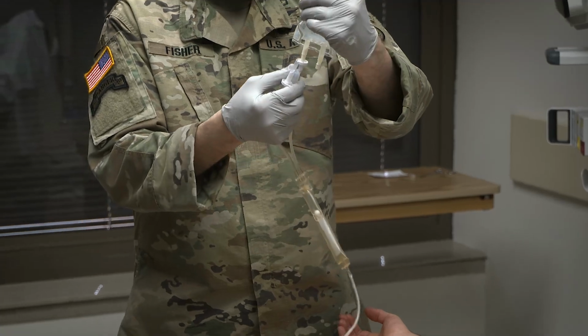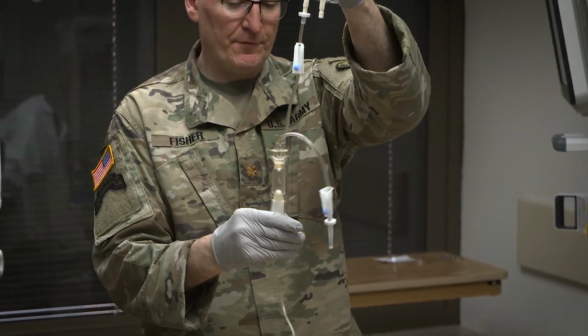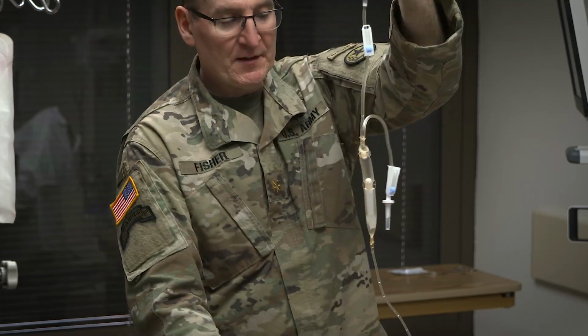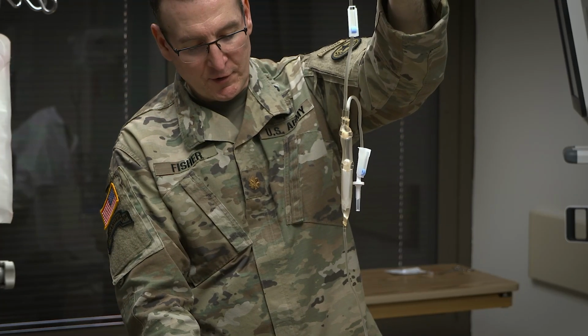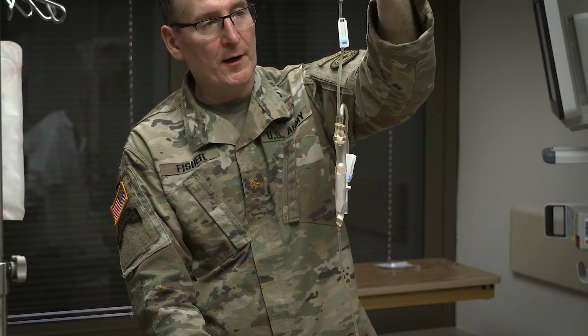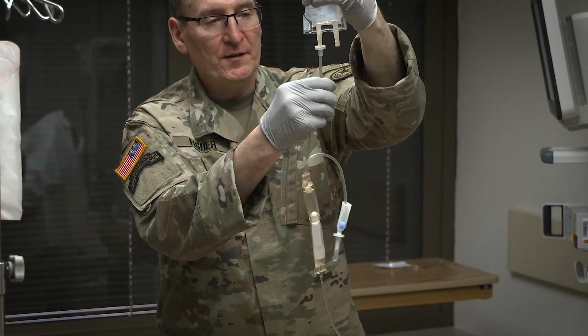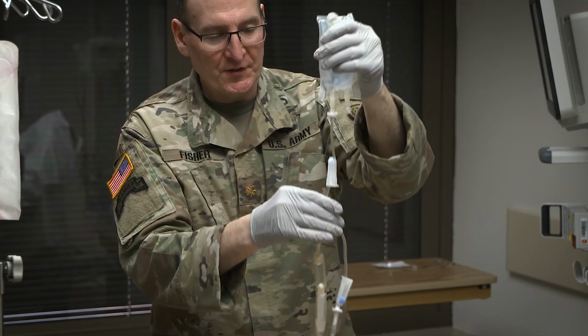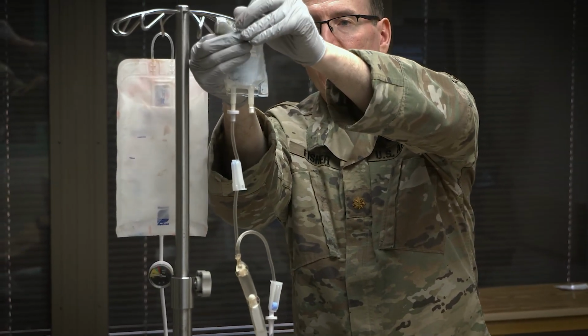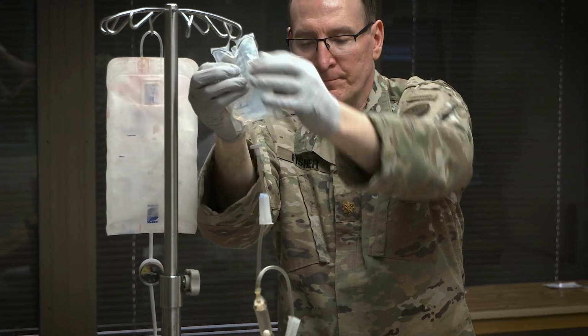You want to go ahead and turn that on, and you can fill up your drip chamber there just like you would any other IV set. Go ahead and turn on the bottom so you can get it to run through, and that is now primed. Go ahead and now turn this one off. Okay, so saline off. I'm going to go ahead and hang this so it stays out of my way.